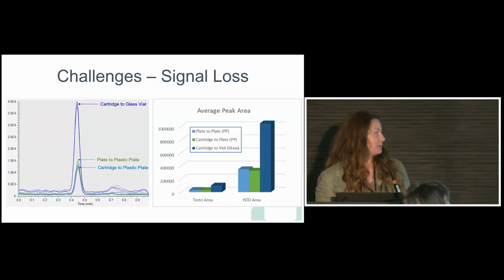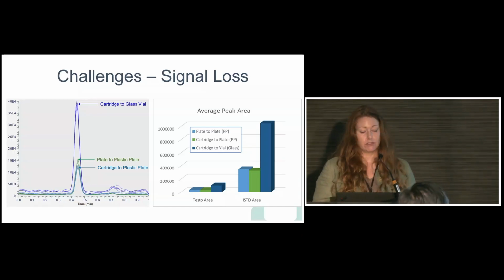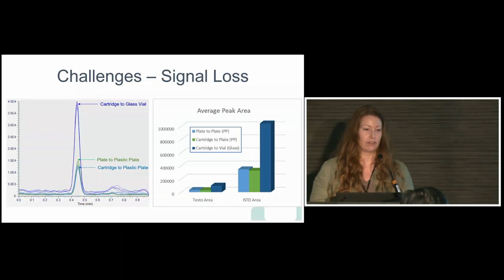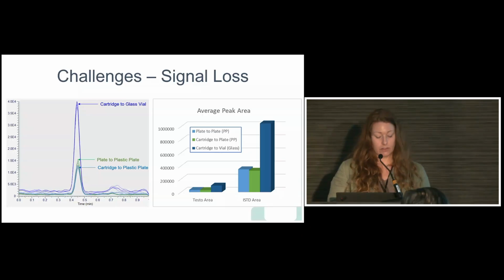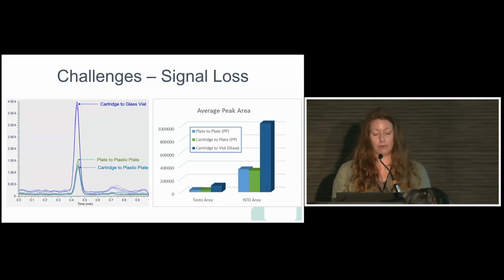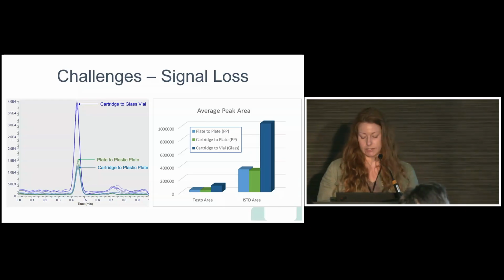So after multiple meetings and spreadsheets, we were able to determine that this was due to the collection vessel. Steroids have high affinity for plastics and laboratory labware in general. So the mitigating resolution for this was that we were able to collect our eluent into glass-coated collection plates. Those are a little bit more expensive, but you're not going to sacrifice losing any of your analyte or sensitivity.